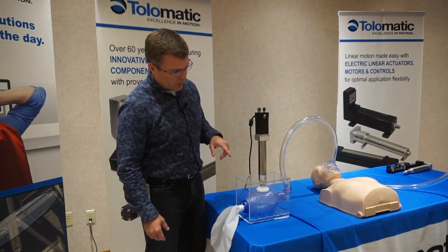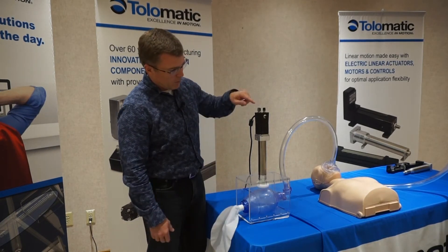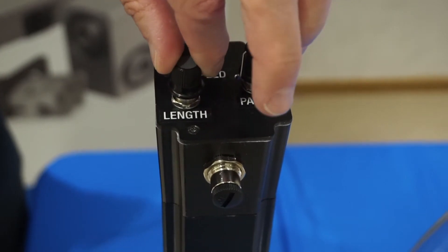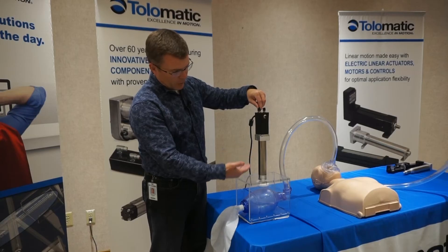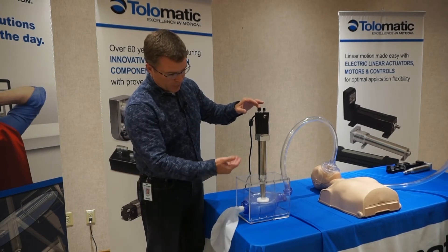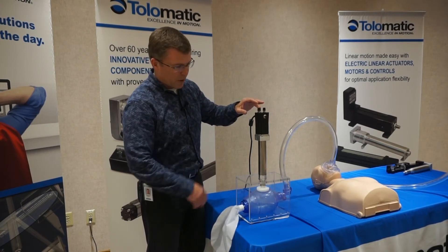A couple things that we can do quickly to adjust what's happening here. I can adjust the length of this stroke — so as it comes back up, the stroke length will get longer. This little potentiometer here allows it to now compress that further.